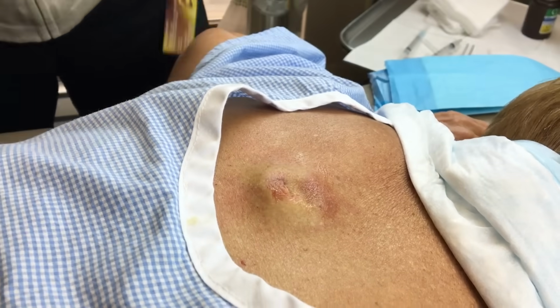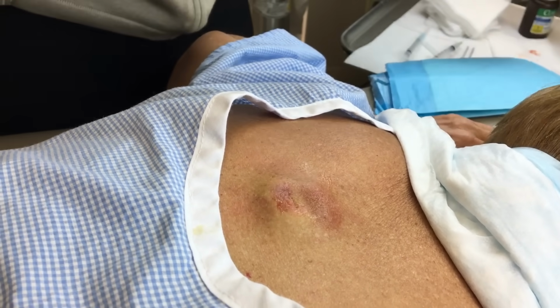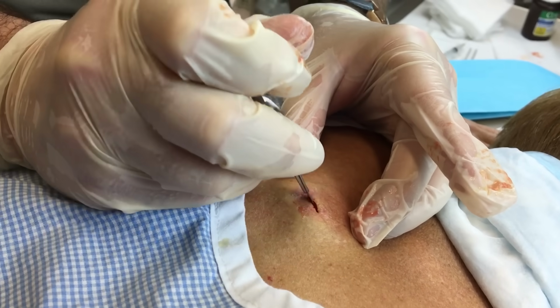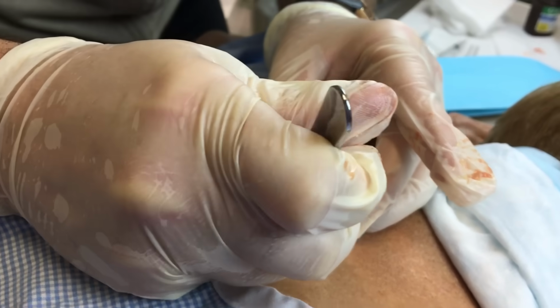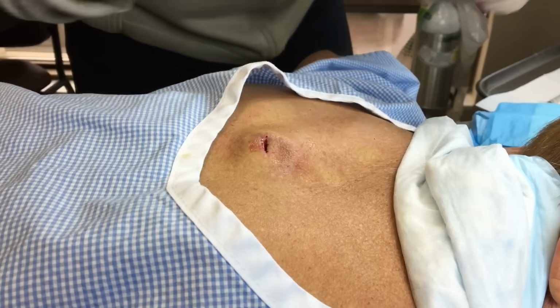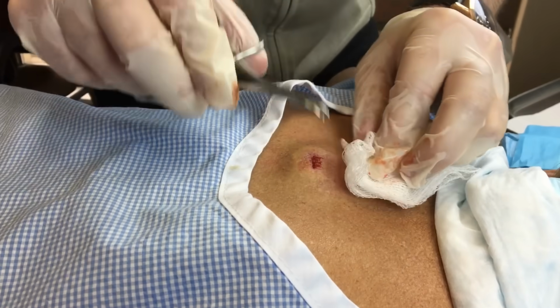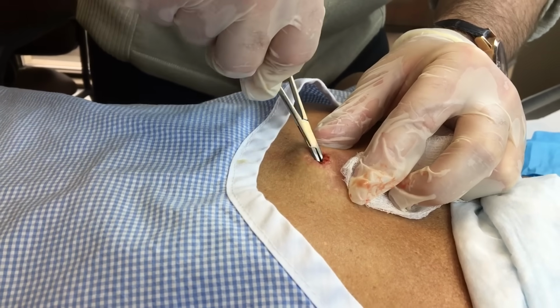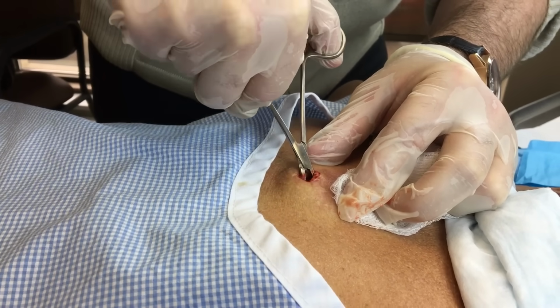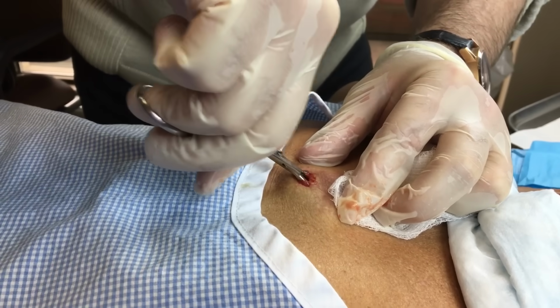Not too bad, no. So with this one, we talked about whether a cyst is loculated. I want to use the number 11 blade just to explore. I can feel a couple areas there, but... Yeah, you'll feel some pressure. Okay. And then I use curved Kellys, which is this instrument here. But I want to be gentle with it because, again, remember, the patient can't have perfect anesthesia with this. So you certainly want to break down some adhesions, but there is a balance.